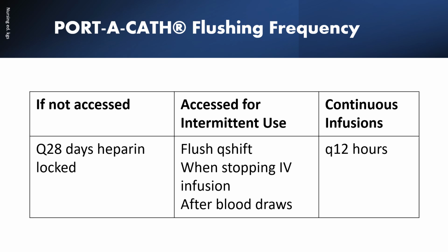If it's accessed or for intermittent use, you'll flush every shift, whenever you're stopping an IV infusion, and also after blood draws. For a continuous infusion, you'll flush every 12 hours.